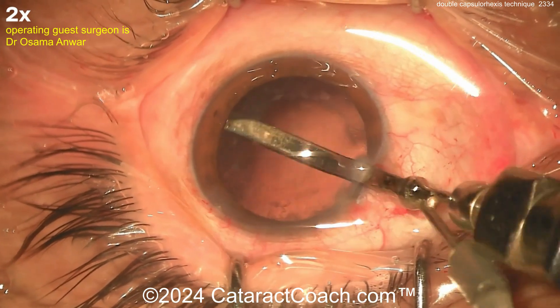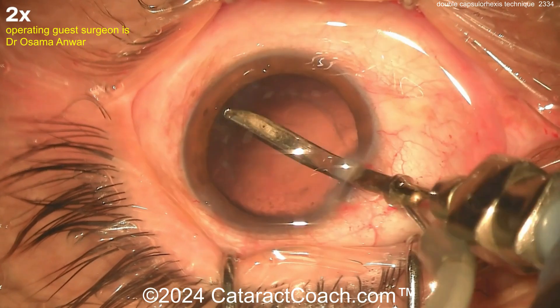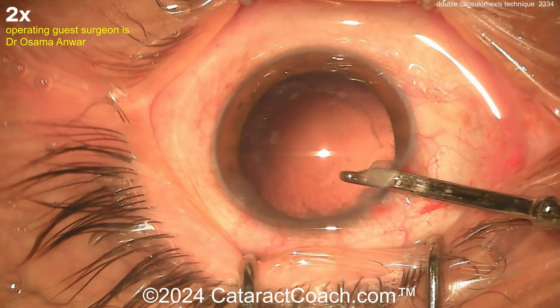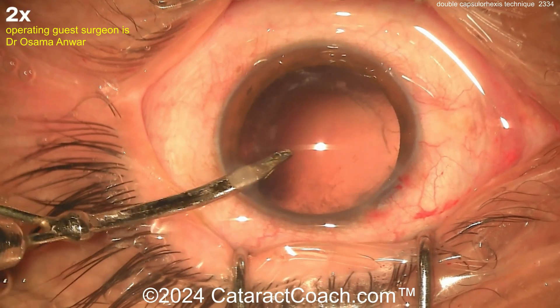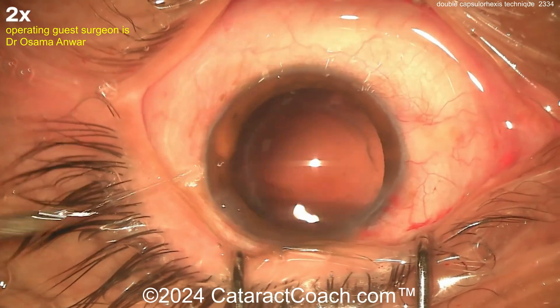Remember what we're looking at is an incredible delta — the difference between before and after. Before, this patient had no vision, hand motion at best, probably light perception. After surgery, this patient is going to have fantastic vision. So if you need to come back in three months and do a little YAG laser capsulotomy, that's no big deal either — you can always come back and do that. Not an issue at all. Everything's cleaned up very nicely here.